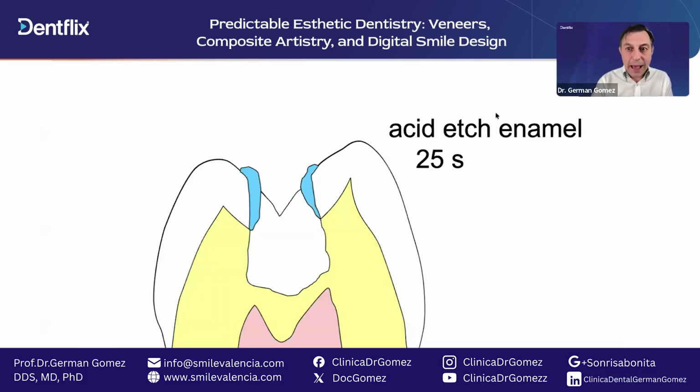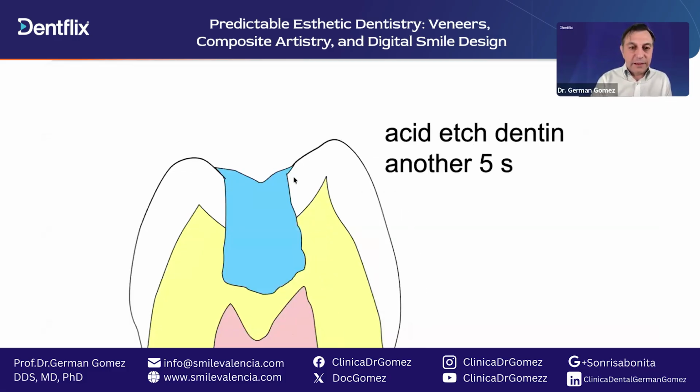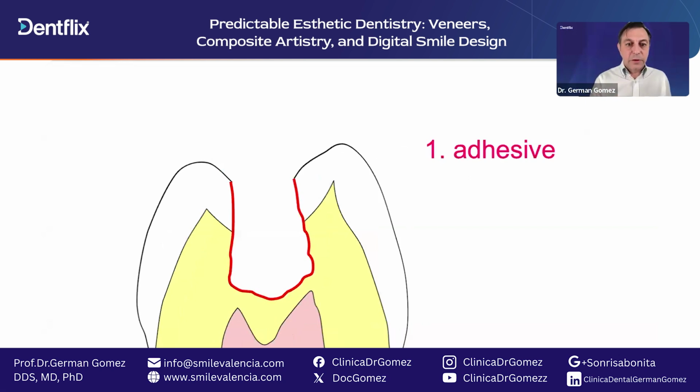So how do we do the acid etching? We acid etch on enamel, and then we wait 25 seconds. Then we acid etch the rest, also on dentin, and we wait another 5 seconds. That means we have acid etched the dentin 5 seconds and the enamel 25 plus 5, it's 30 seconds. Then we put the adhesive.